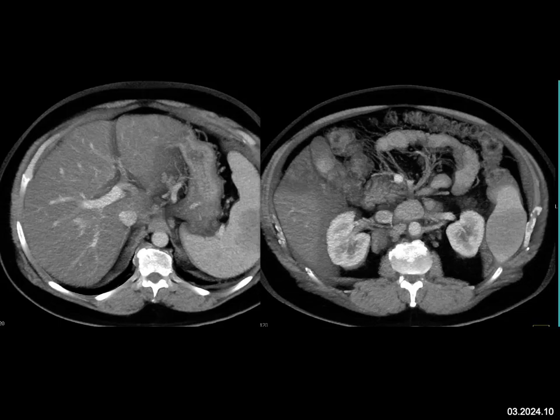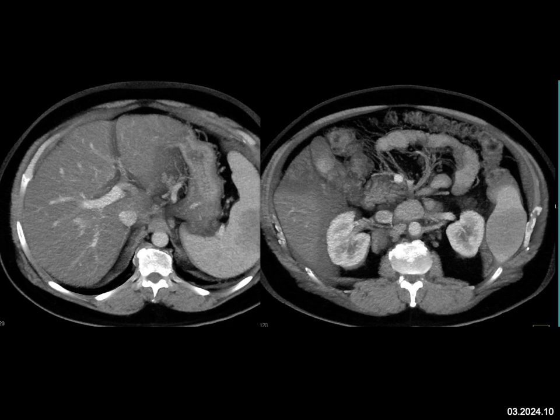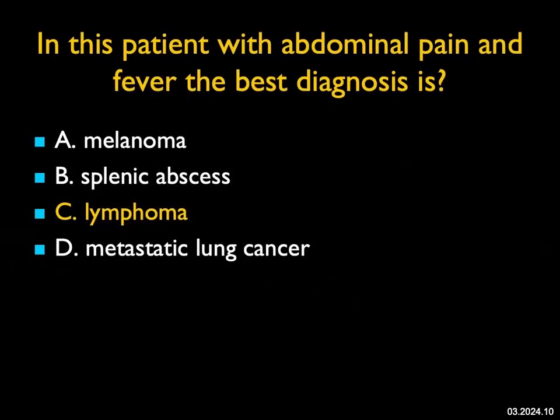In this patient with abdominal pain and fever, the best diagnosis: the liver looks irregular in texture, there are peripancreatic and periaortic nodes, and several masses in the spleen. Melanoma can cause this, and splenic abscess is a consideration — but we're talking about at least two lesions and it would likely not explain the adenopathy; splenic abscesses are also more cystic. Metastatic lung cancer is a theoretical possibility but unlikely. The best diagnosis is B-cell lymphoma, which can involve only the spleen, have single or multiple lesions, and also show adenopathy.